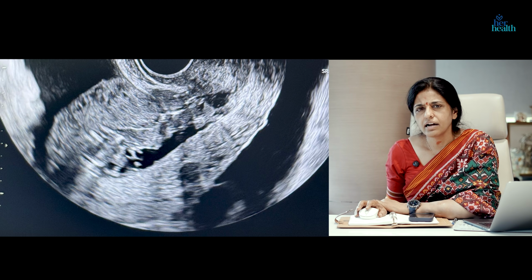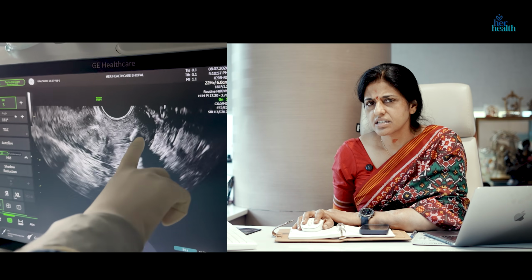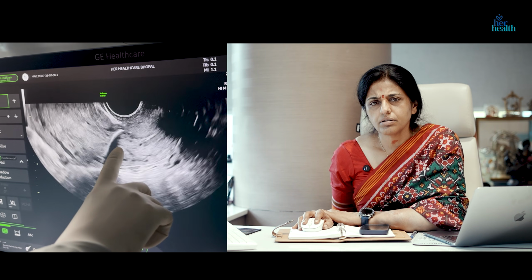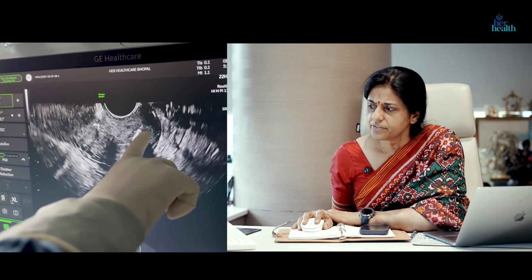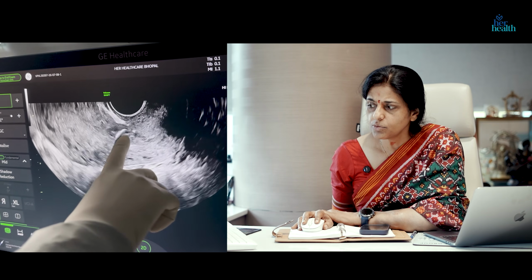So this patient had a second trimester miscarriage with us. She had an open os at 16 weeks and unfortunately lost the baby. She would go to her local doctor after the miscarriage with heavy bleeding. Every time, everybody would see the uterus and say that everything is normal. But see what we found.